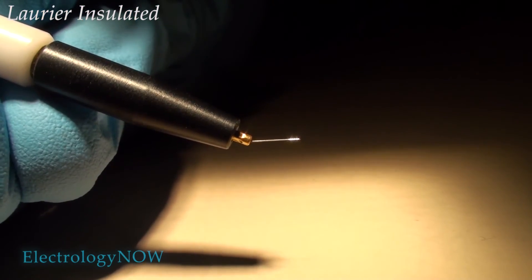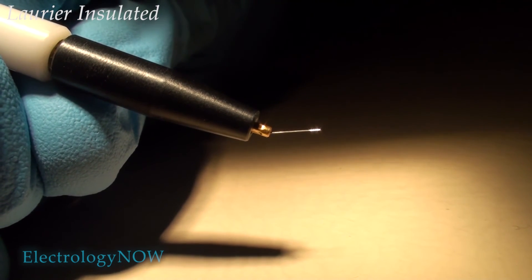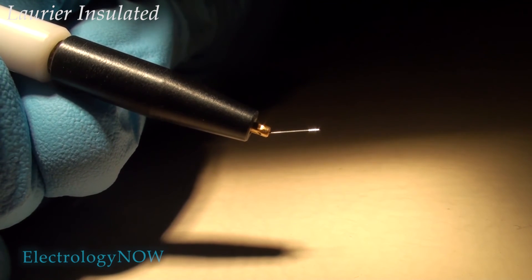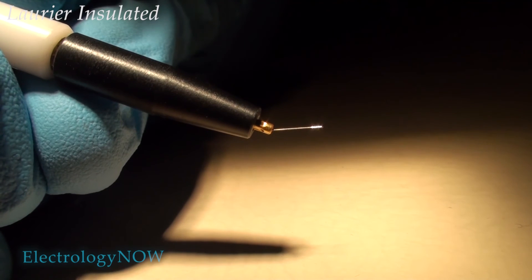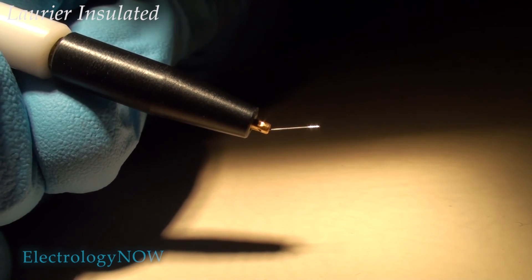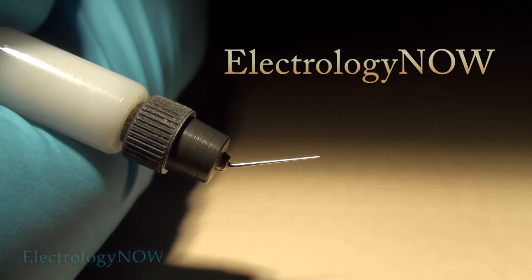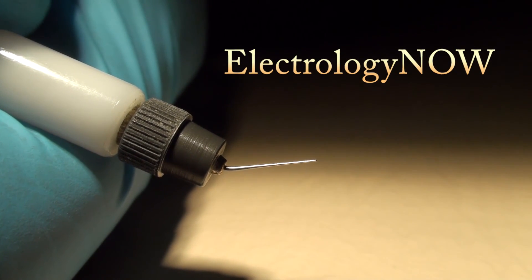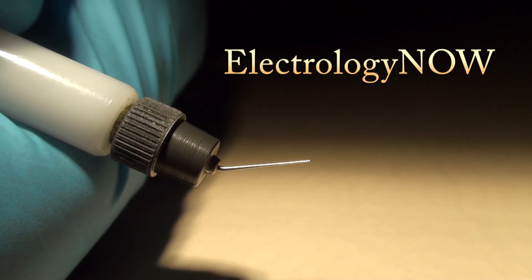Under normal usage, you will place the shank further back in the needle holder. I've left the shank exposed here to show you where the bend can be placed. This is the Laurier insulated needle. If you're working on hairs that are growing flat to the skin at an oblique angle, sometimes a bent needle can help you with your insertions.